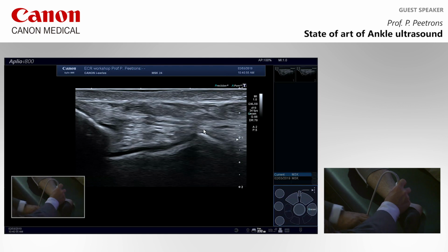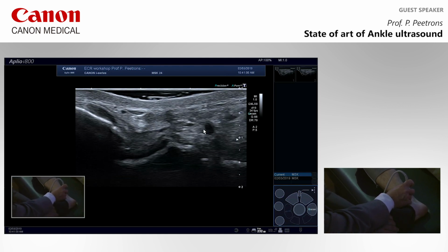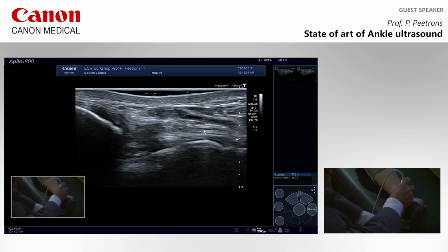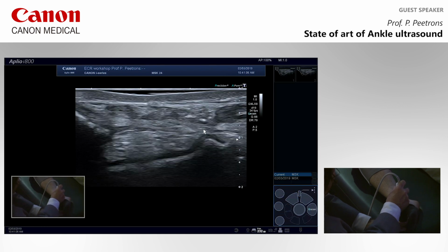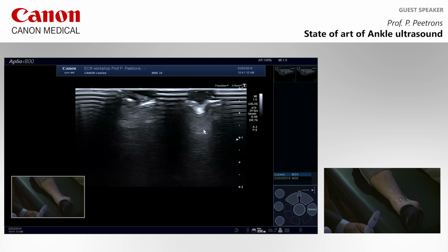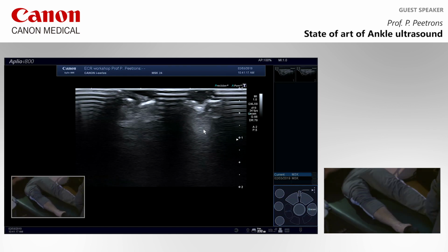Okay? If you do the reverse position, impossible to see. If you dorsiflex, impossible to see. It is, however, very difficult to see when you have the good position, but it's clearly impossible to see when you have the bad position. Okay? So it is not the fault of your equipment, it is the fault of your brain. Okay?